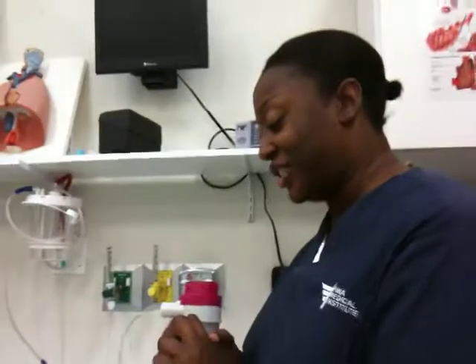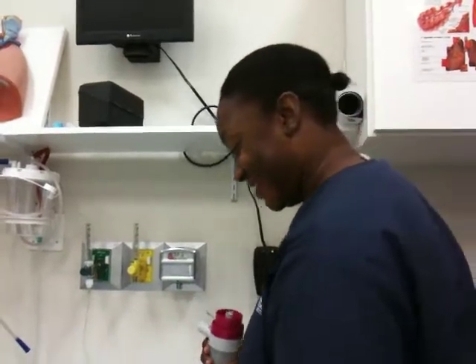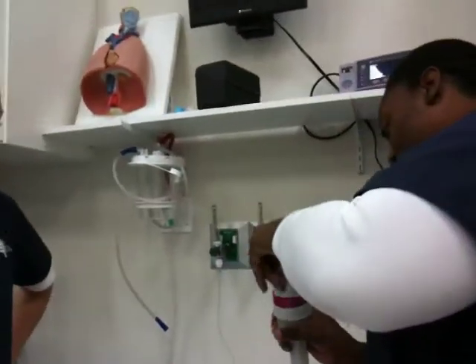I got Tanisha on video. Today I will be showing you how the floor charm works. Now don't pay attention to my fat cheeks — pay attention to the method here. It's all purpose. There's no room for vanity here. That goes out the door when you go into the hospital. Anyways.